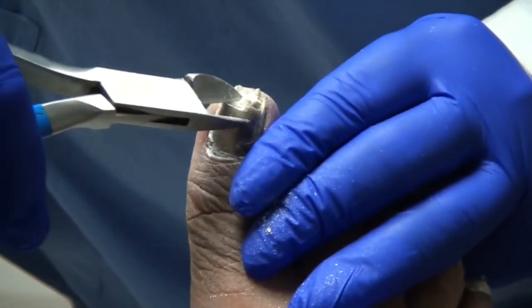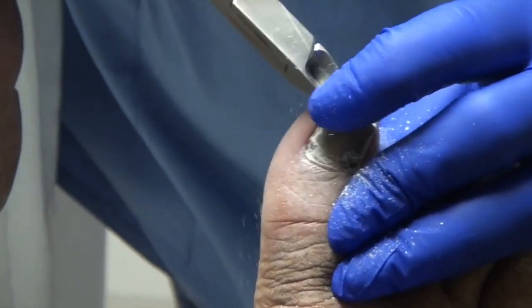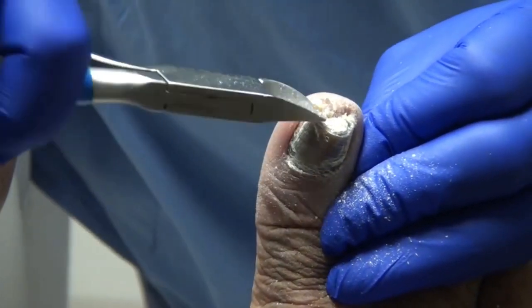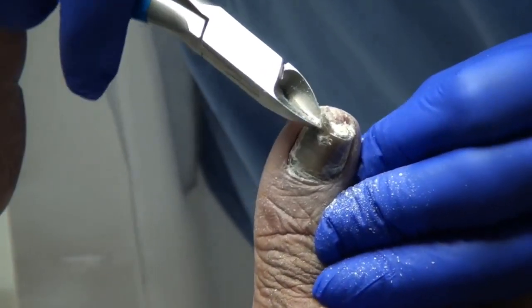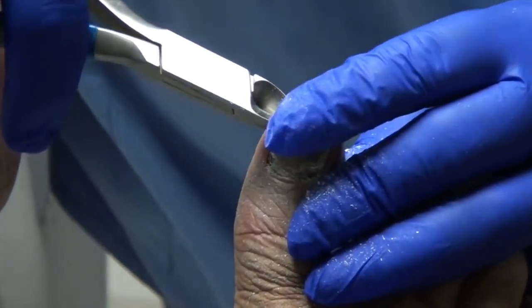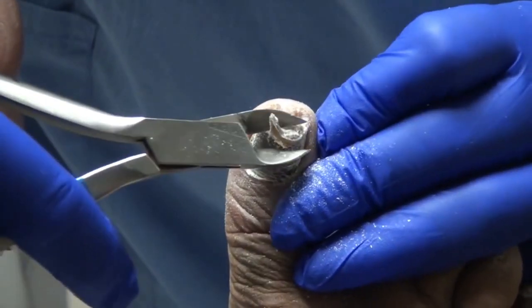I need you to relax — there you go. I know I scare everybody. Now I'm going to take these back and see — if you do it along the line of the nail, along the shape of the nail, now it's straight across. But still with a drugstore little spring clipper, you're never going to be able to get this. So I'm just taking off a little bit of the thickness here, and I'm going to leave those corners so that they're straight across.